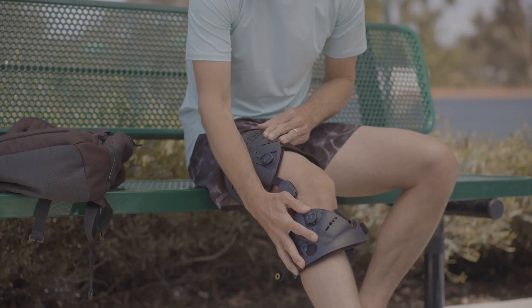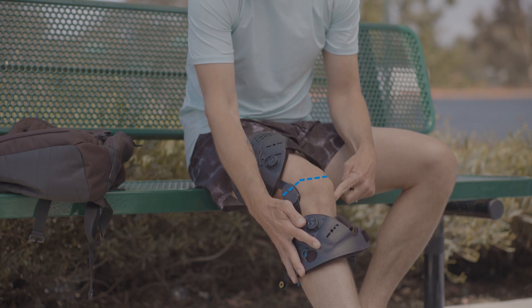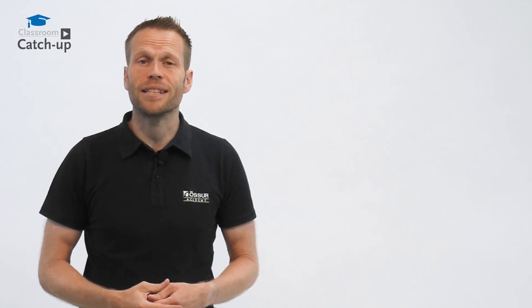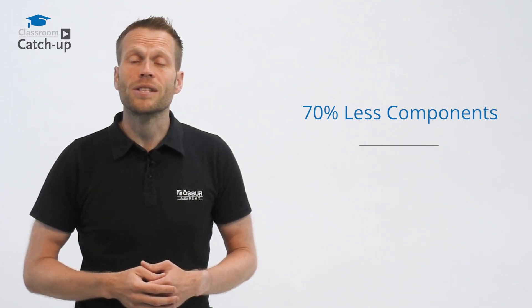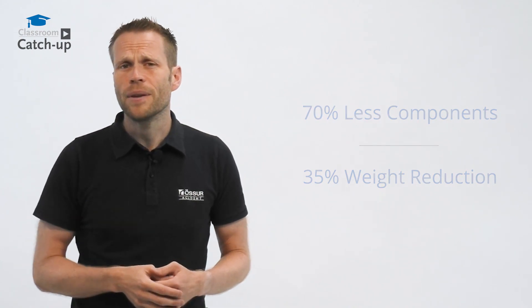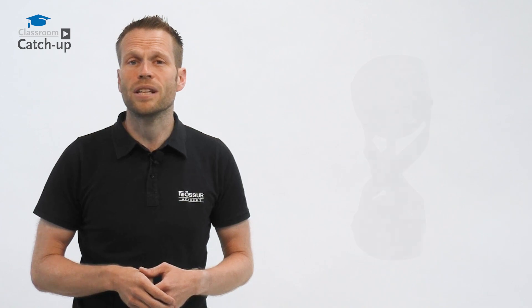We still retain the Össur logo, which is used to verify the height of the brace by lining it up with the top edge of the patella. Using the latest in design, manufacturing, and materials with enhanced reliability and consistency whilst reducing individual components by 70% and eliminating excess waste in manufacturing — all this whilst adding a 35% weight reduction. But more than that, this is a hinge that you can rely on for being more readily available and stronger, to help reduce costly additional wasted appointments.